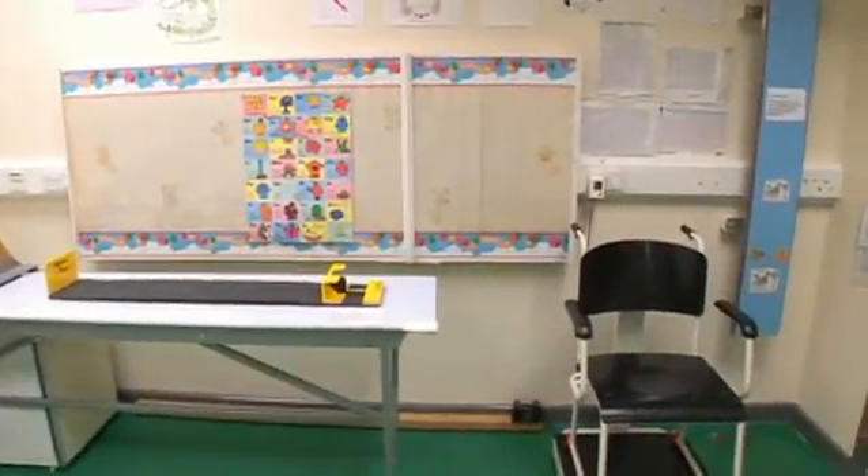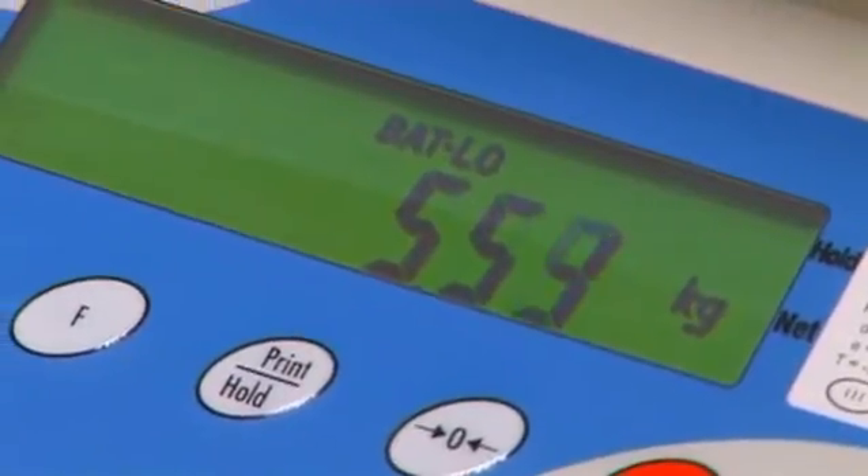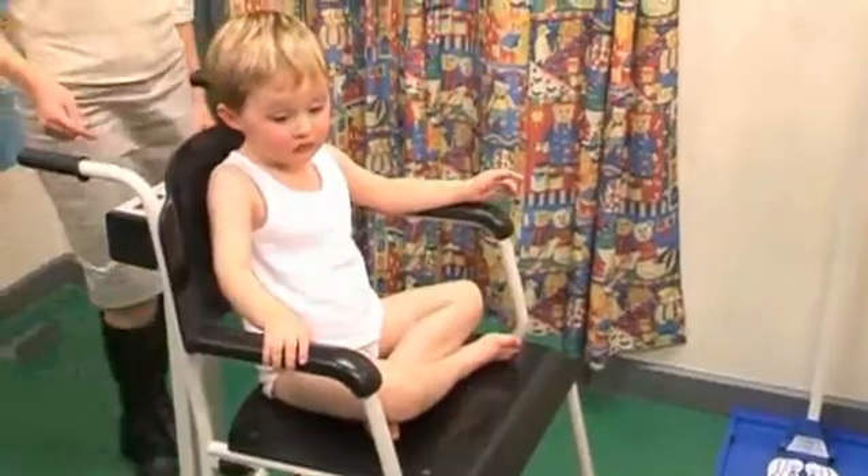Shall we look at weighing first? What type of scales do you use? We use digital scales here. There are now European guidelines when you purchase your scales. We use baby scales that weigh infants up to 10 kilograms, and then we use sitting scales and also standing scales too.